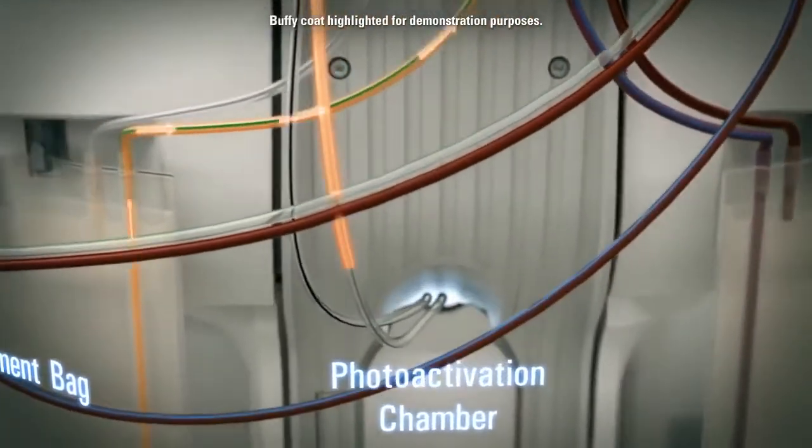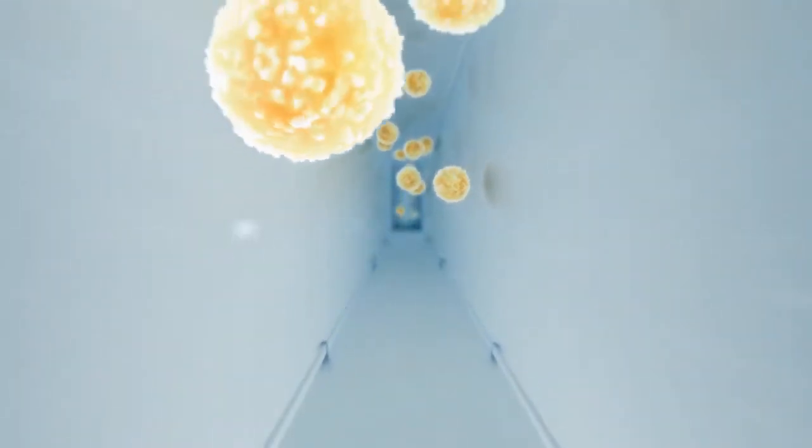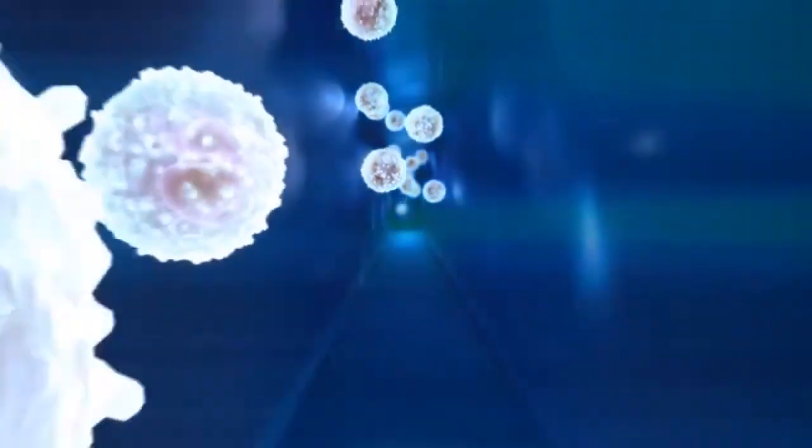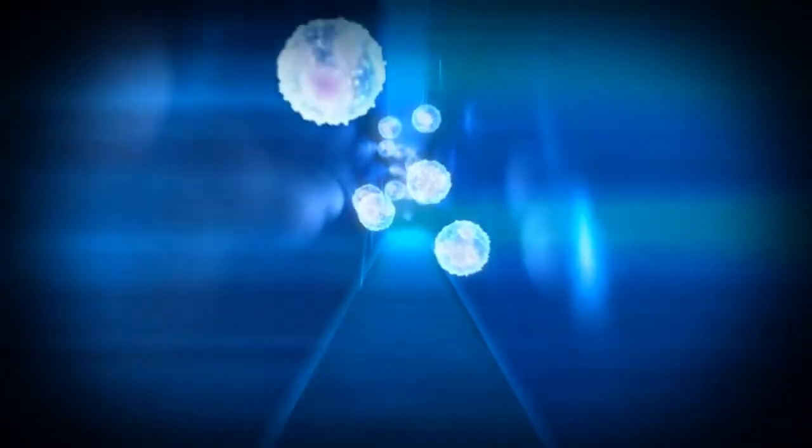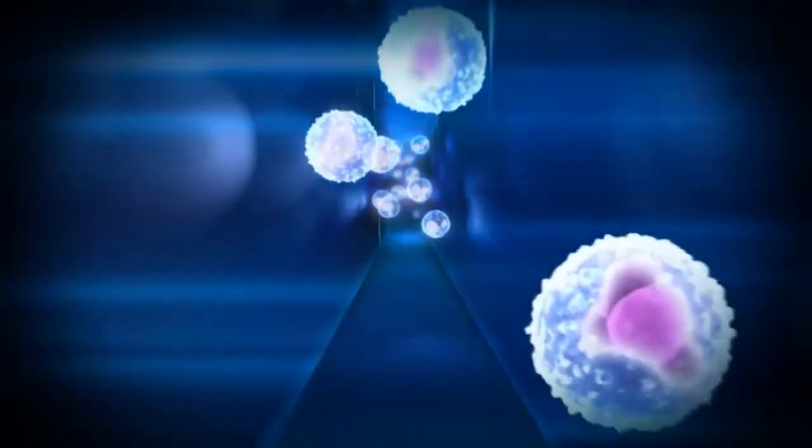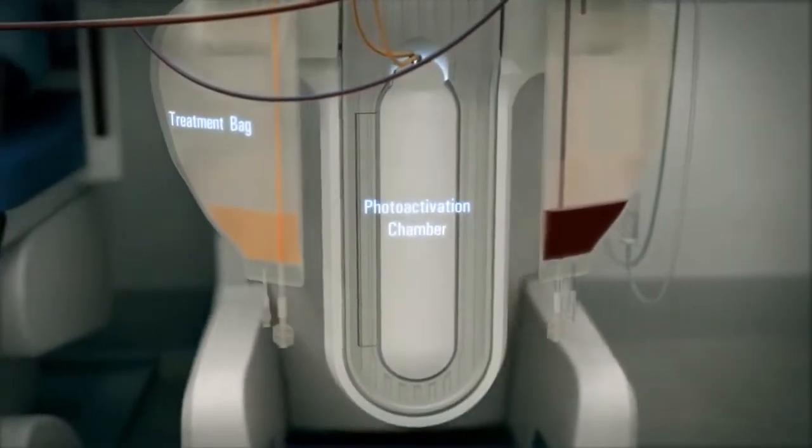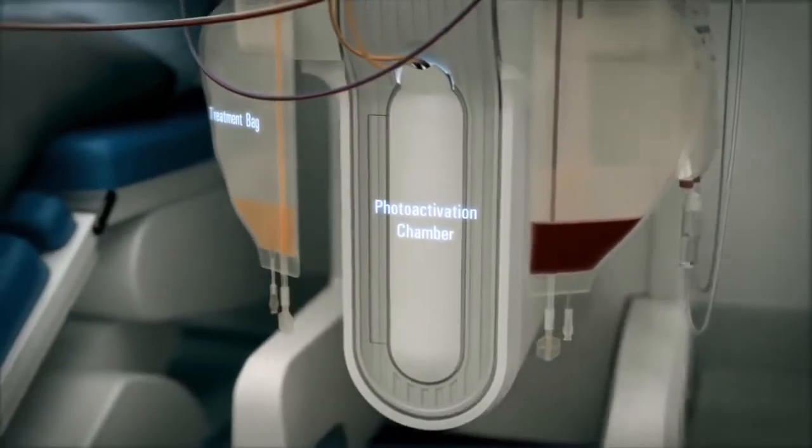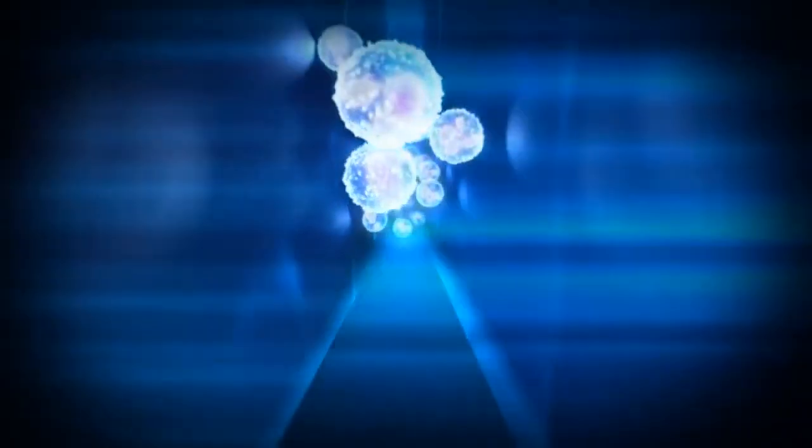Recirculation begins as the treated buffy coat passes into a photo plate which has been designed to provide consistent treatment of leukocytes with continuous recirculation. The cells are treated with approximately 1.5 to 2 joules per centimeter squared of ultraviolet A UVA light which activates the methoxalin and causes it to permanently bind to the DNA, programming the cell for death.